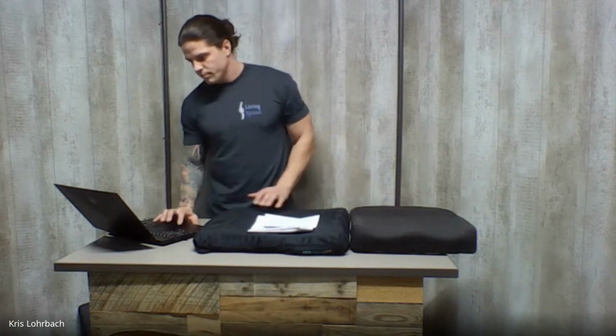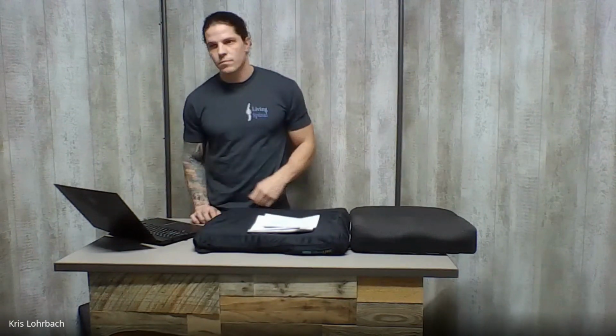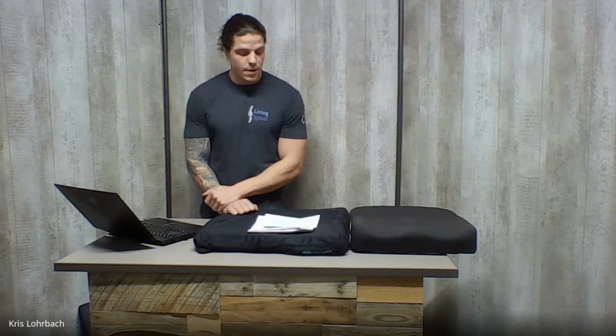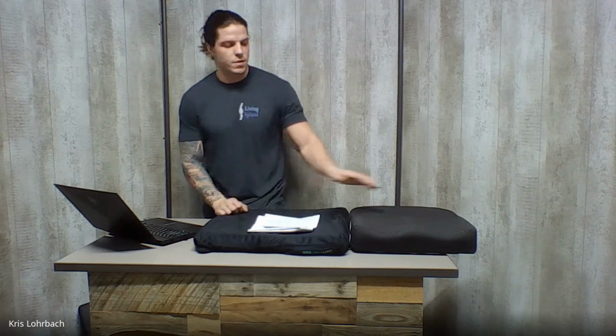Is it easier to transfer on one of them? Like, is a non-contour compared to a contour, is it easier to transfer on a flat? It's a good question. So Andrew can probably chime in. I think it is easier to do on a flat because there's nothing that can catch you.